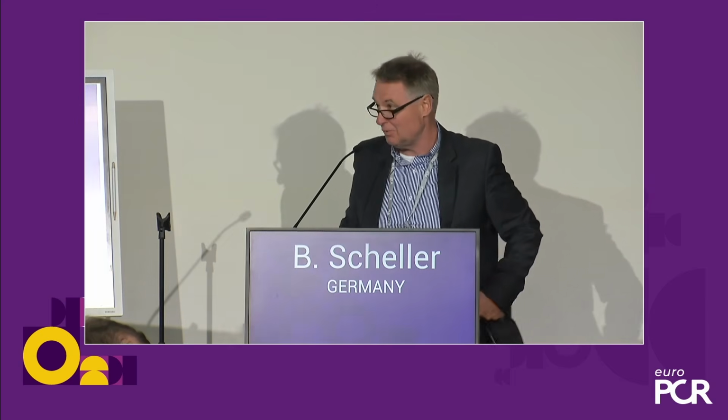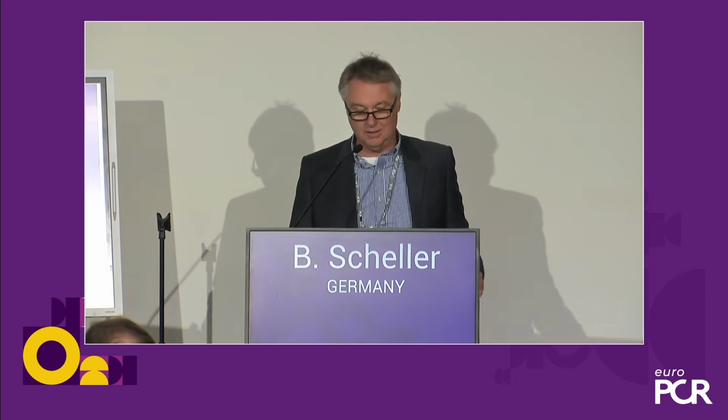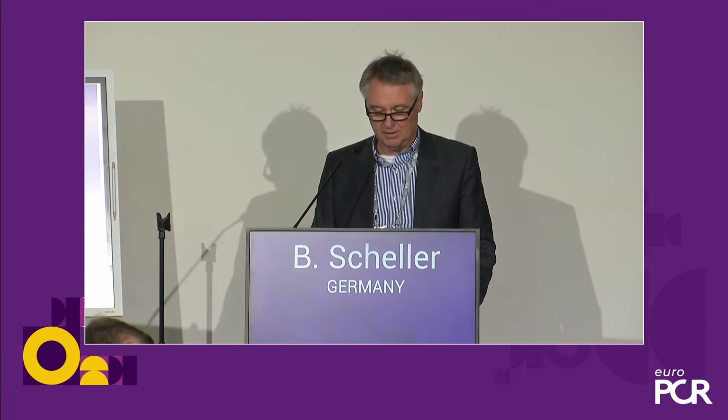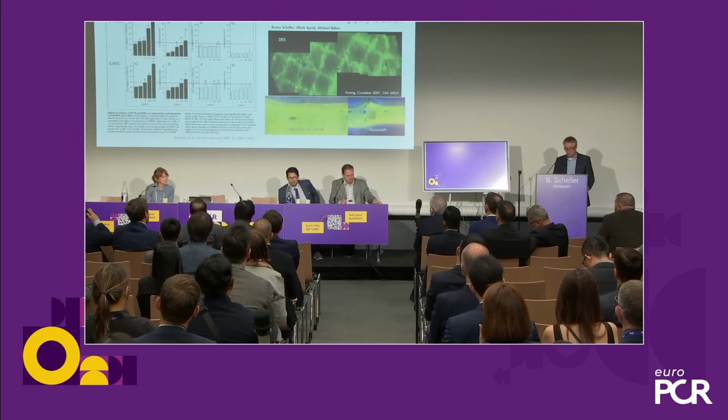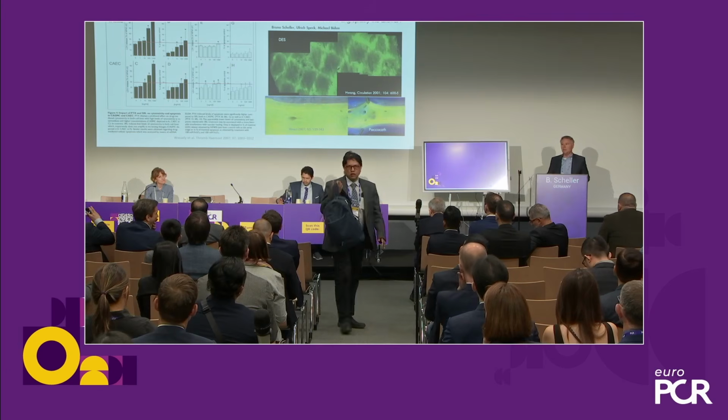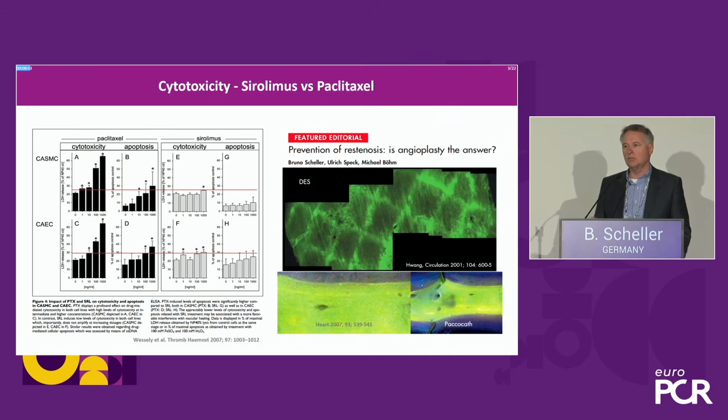Sure, that's a big question at the moment. Is there a role for limus besides paclitaxel? I mean, we have all this fantastic data, meanwhile, for paclitaxel-coated balloons. I want to start with a remark about the discussion about cytotoxicity and cytostatic properties. Most people claim that paclitaxel is cytotoxic and sirolimus is cytostatic.